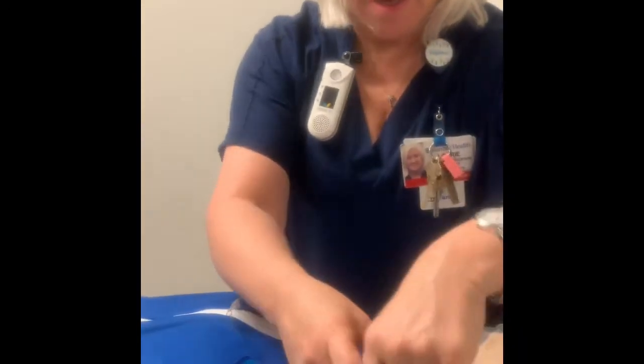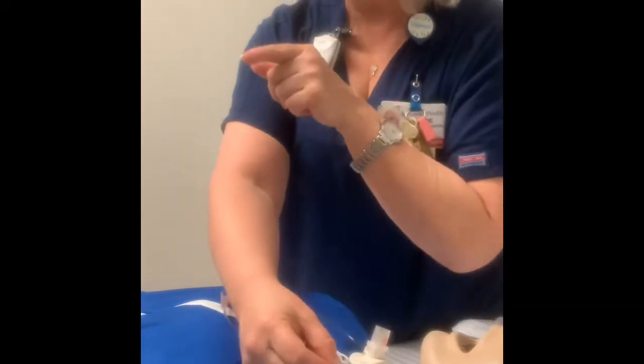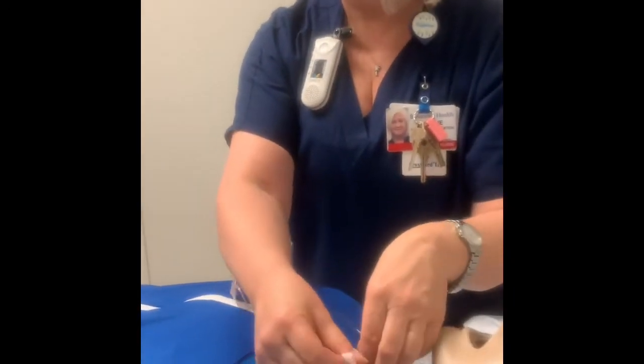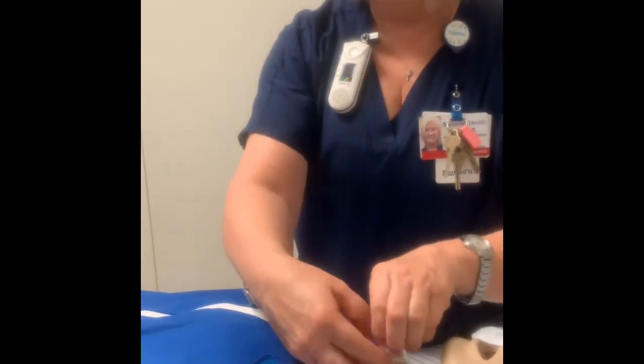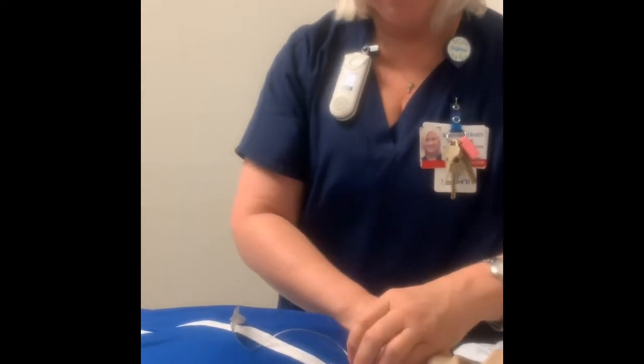Okay, so let me put this trach back in him here. Put my ties back in. So what am I going to do if my trach falls out? Cover the stoma, ventilate the mouth if you can. Okay, if not, ventilate the stoma.